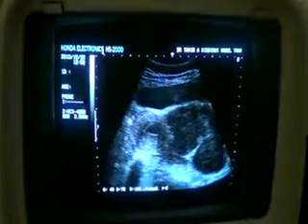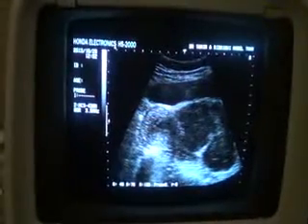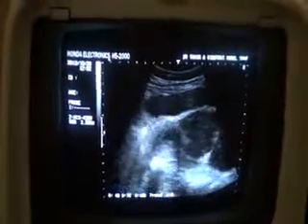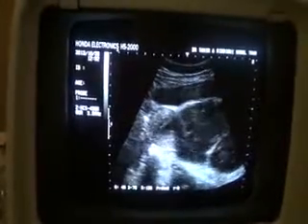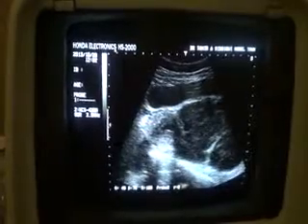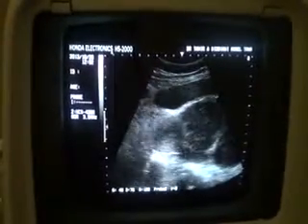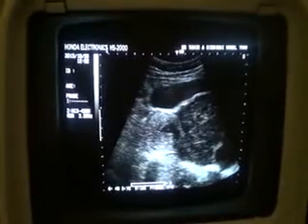Pelvic scan of a 40 years old female with a history of menorrhagia. Because of the bulging lower abdomen, I can get this portion of the uterus transabdominally in longitudinal section.